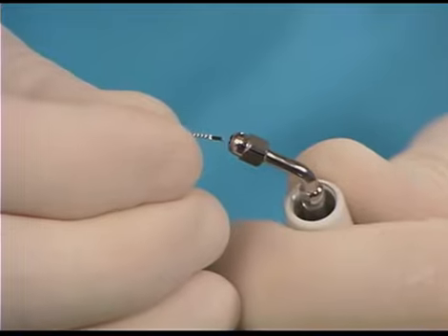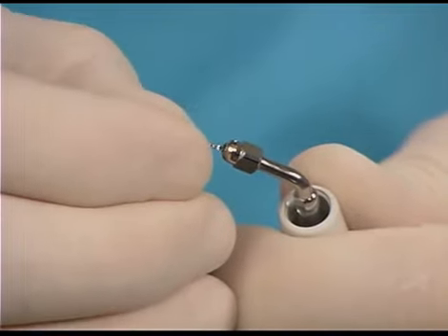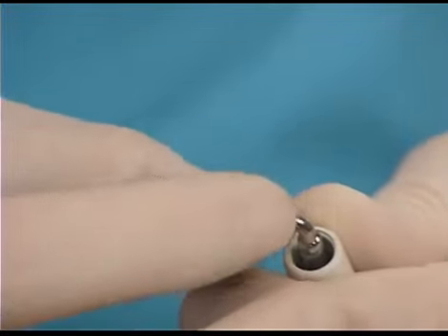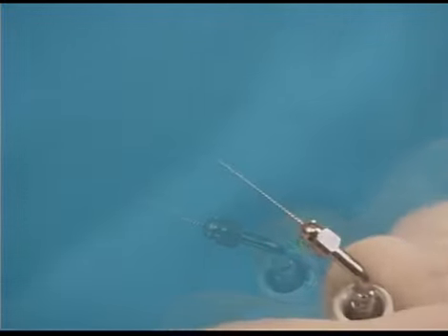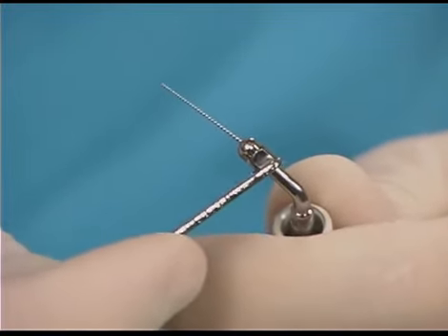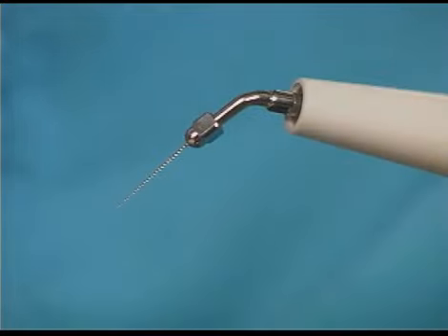The file adapter threads onto the ultrasonic handpiece, and its chuck will retain an O2 tapered hand file. Although tedious, small stainless steel hand files can be pre-curved, inserted into available space, and used at low power in an ultrasonic effort to remove a broken instrument. This technique is at times useful when the root is thin and/or the canal is curved.